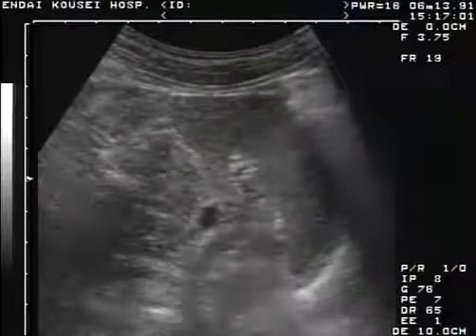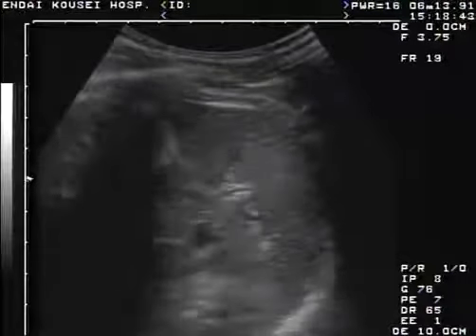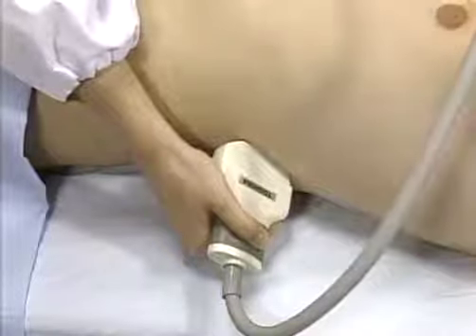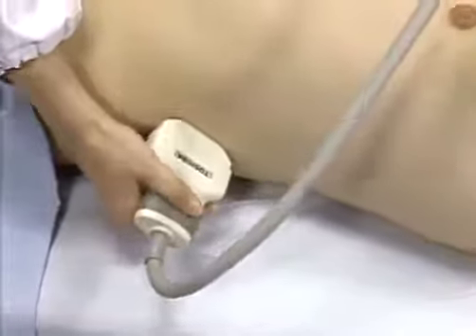The spleen closely reflects the condition of the liver. A splenic abnormality suggests hepatic disease. This finding is helpful in evaluating the liver later. At times, a swollen lymph node can be detected in the periphery of the hilum of the spleen. As you see, the spleen looks the largest in this plane.